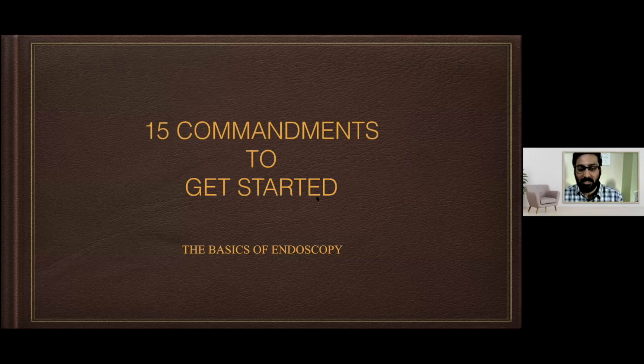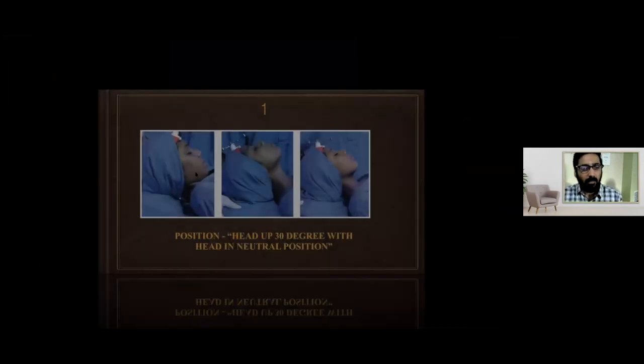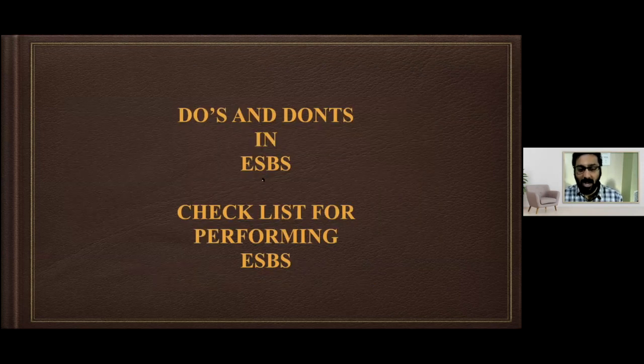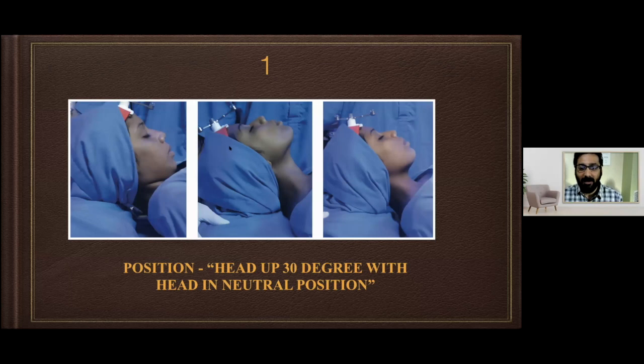I formed a checklist. So basically, this is how you get started. When you start operating, you have three positions of the head. Try to have what's called the neutral position. Of course, in the cadaver you can't do that, but while doing surgery, if you want to do the odontoid, this is what is called the dynamic head position.